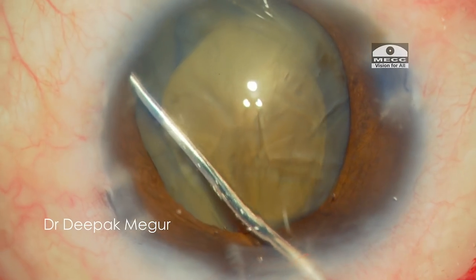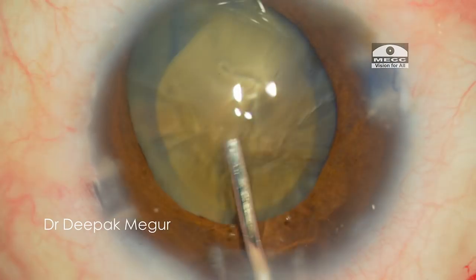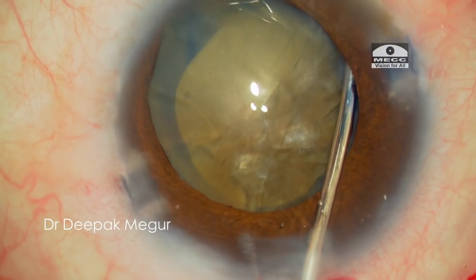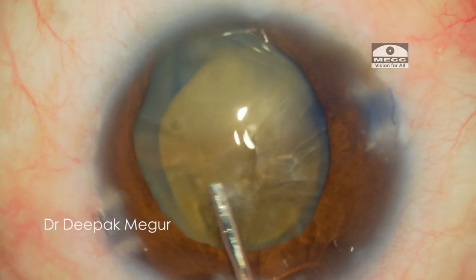Hydrodissection is being performed very carefully to avoid over-distention of the capsular bag. A very little amount of fluid is used, immediately followed by gentle decompression. This is repeated at different sites.